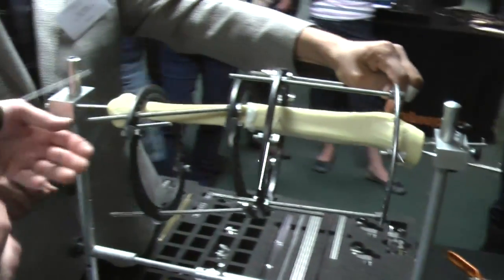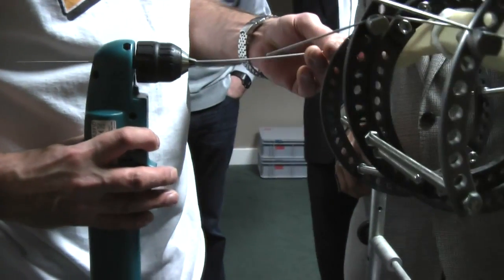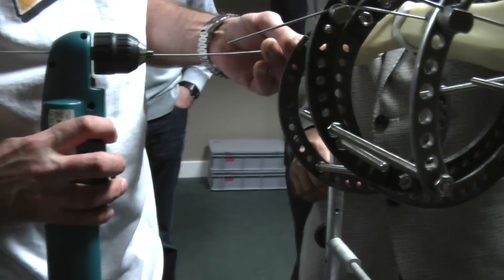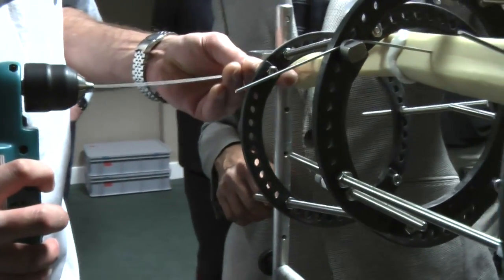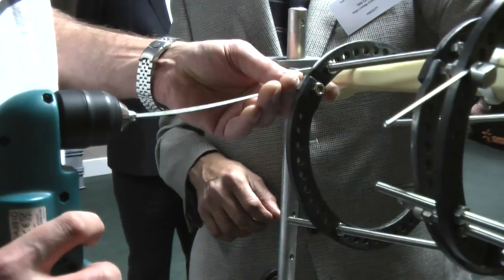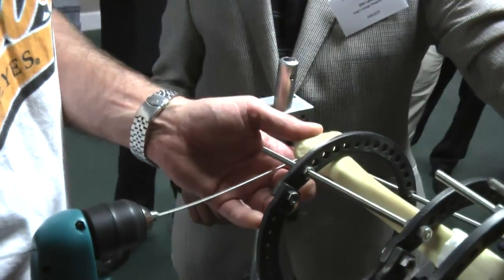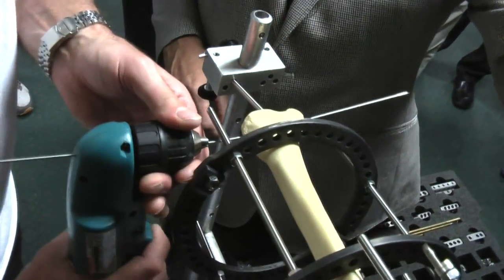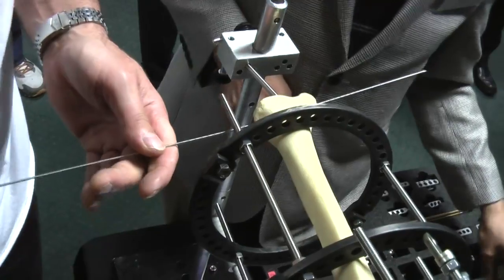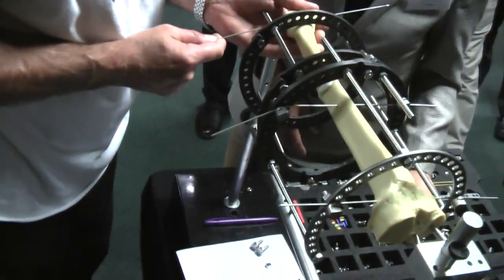And I say parallel to the ground is a useful thing because everybody can see it. Okay, so there's that reference wire.